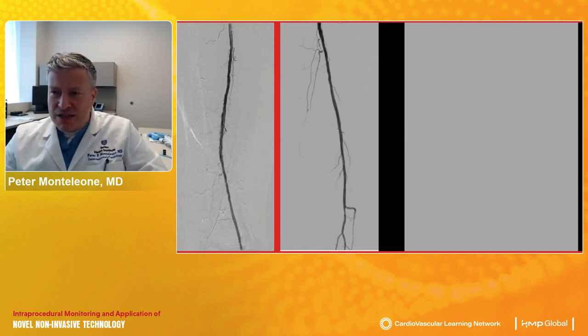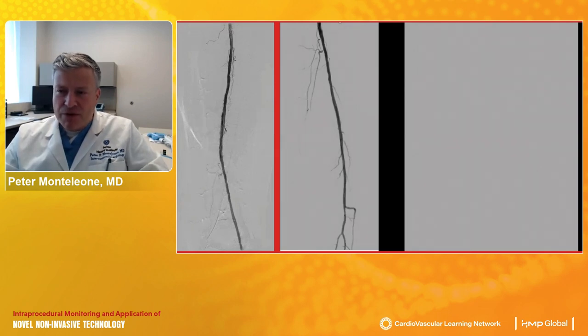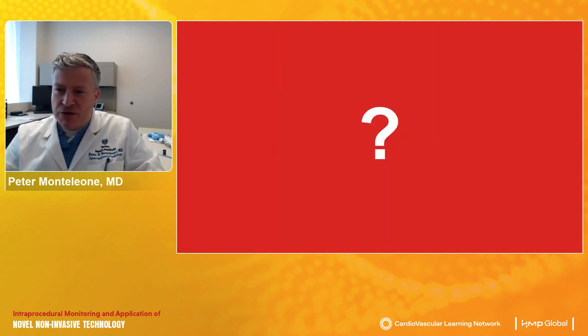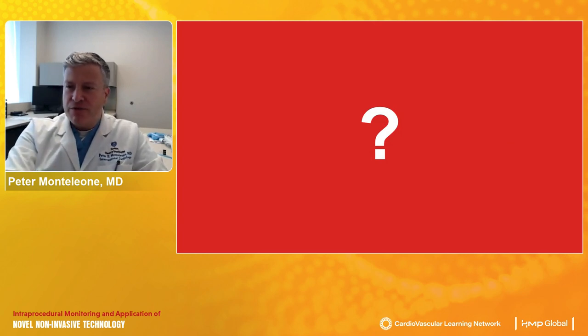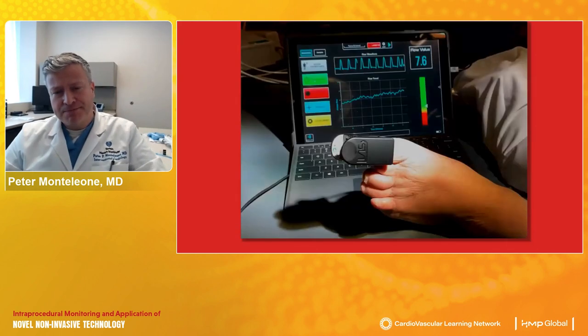Now, certainly this was a case in someone with rest pain and with kind of complete inflow revascularization of the SFA and popliteal, we might decide to stop. But if there's a focal lesion located somewhere downstream of the tibial vessel, you can just imagine how helpful that alternate monitoring of actual tissue perfusion can be. And so in a world with tissue perfusion monitoring, like we get from the Flomet device, I wanted to run you through kind of a number of different types of scenarios that we've come across, even in our early experience.